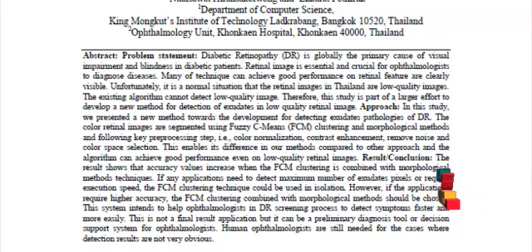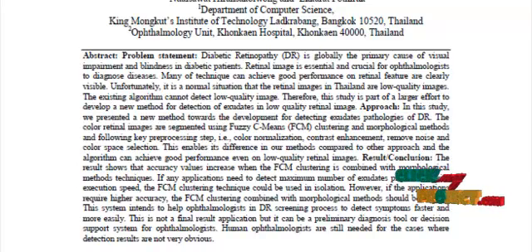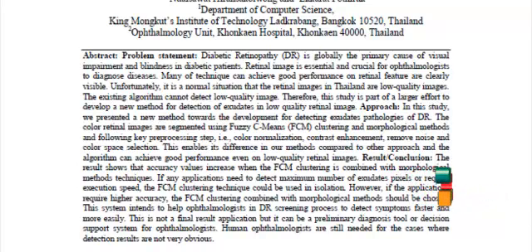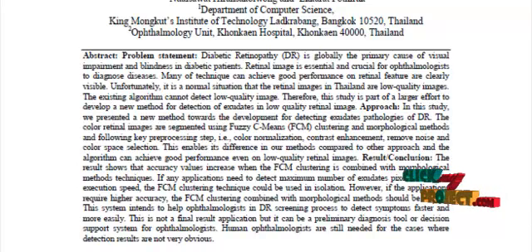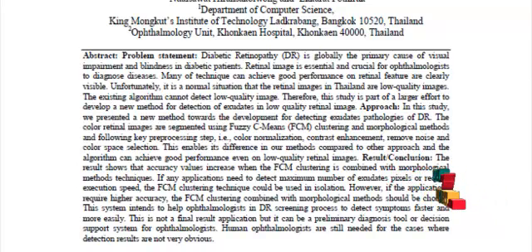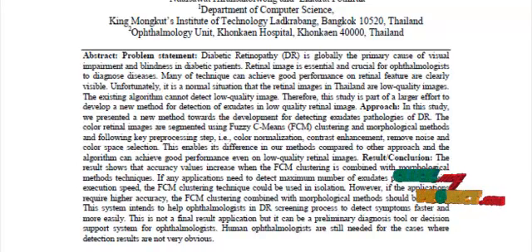The probabilistic neural network classifier classifies input retinal images into four categories: a normal image, exudate defect, hemorrhage defect, or micro-aneurysm defect. These four defects are identified and the results are displayed.